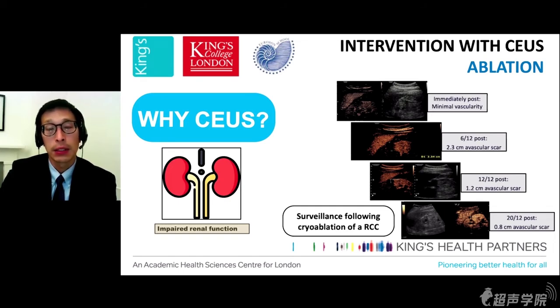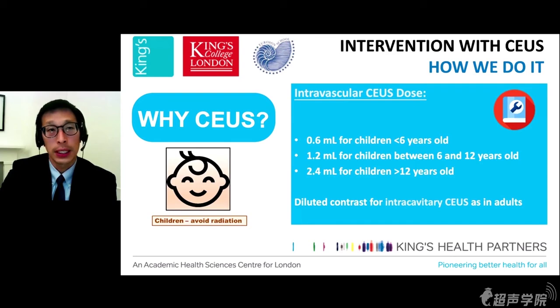Again, looking at patient groups at risk, clearly children and radiation is not a great combination, so we perform a lot of contrast enhanced ultrasound, particularly in the pediatric population. And just a little bit about how we do it. For intravascular contrast enhanced ultrasound, we give a reduced dose compared to the adult, based on the patient's weight or age. For intracavitary ultrasound, the diluted contrast technique is the same as applied in adults.